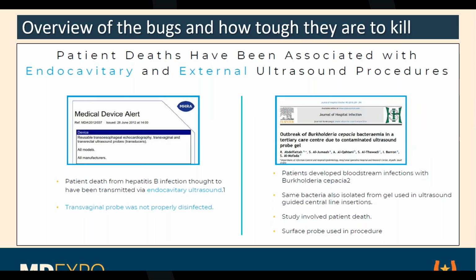They're published every month in the MDR database, and there are alerts that the OEMs typically send out to the clinical end users. So it really starts with the FDA document on reprocessing medical devices in healthcare settings: validation methods and labeling.